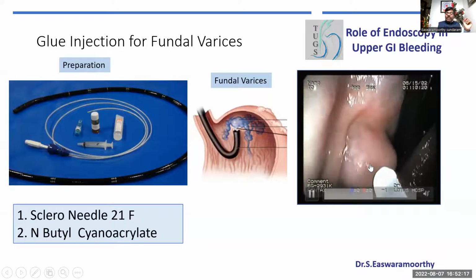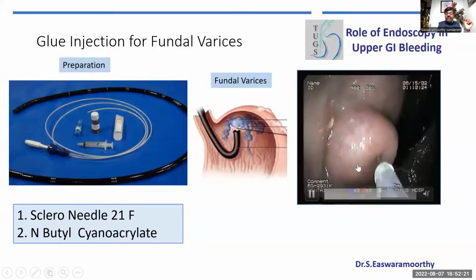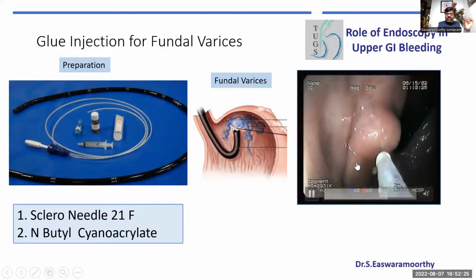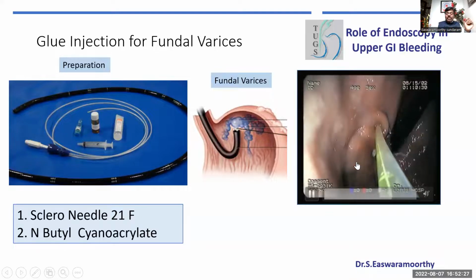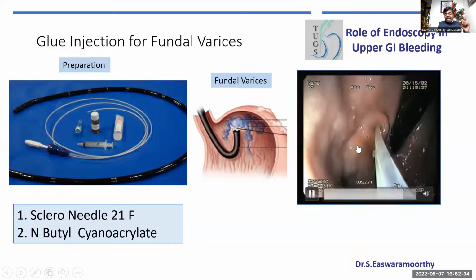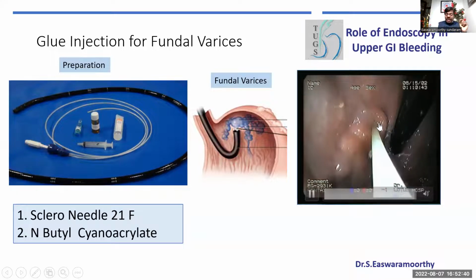There may be better ways of addressing this now, thanks to the endo ultrasound, but this is the simplest way. You can go with a wide bore needle, bullseye, you go right into the varices, you inject 1 ml, followed by 1.5 ml of distilled water, which will drive all the glue from the plastic into it. Then withdraw the needle, keep the hub of this plastic there for a minute, so that the hole is sealed with this plastic, so that there won't be undue bleeding.